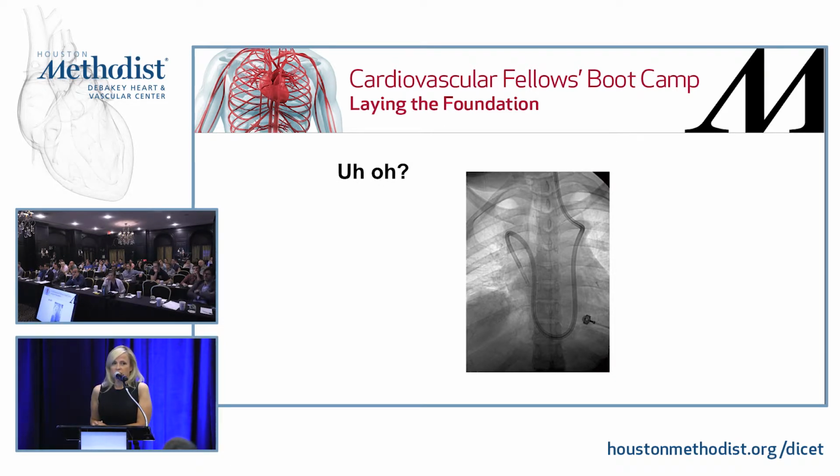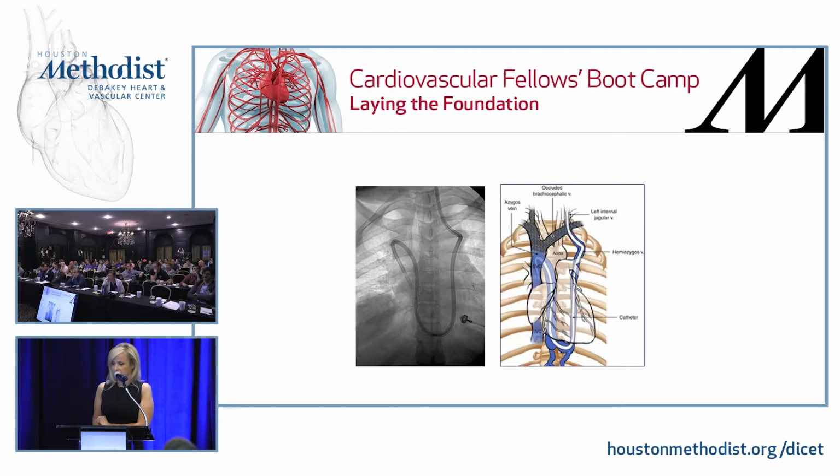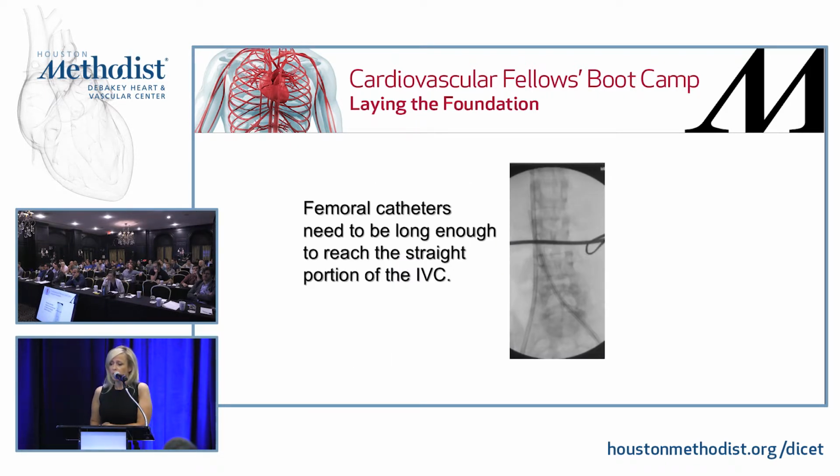Would this be okay to leave the catheter in like this? Yes, it would. So this one went through the accessory hemiazygous, back up through the azygous, and the tip is actually in the SVC. So that's just something to keep in mind. Femoral catheters need to be long enough to reach the straight portion of the IVC.